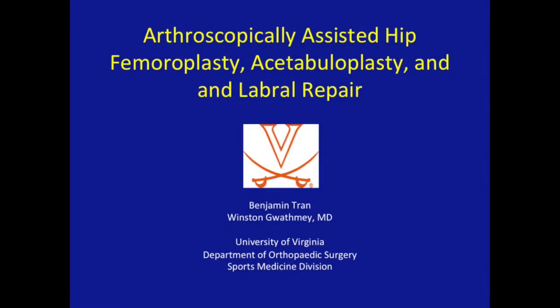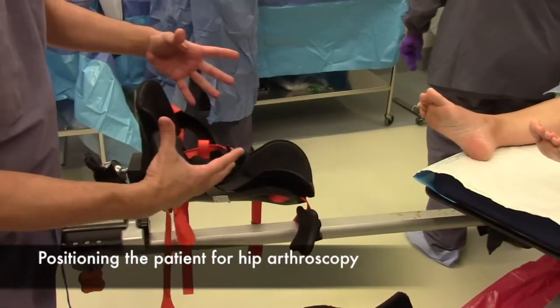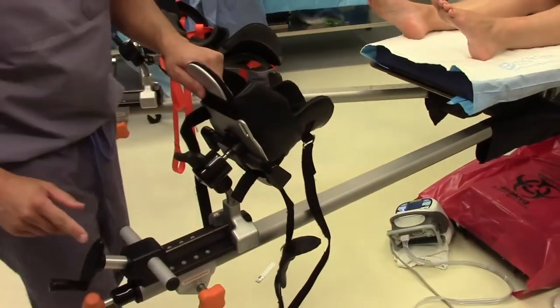Thank you to Benjamin Tran for helping put this video together about hip arthroscopy. The hip arthroscopy table is an attachment applied to a regular table with which we can apply traction safely during hip scopes.